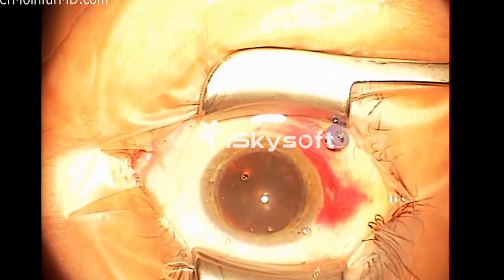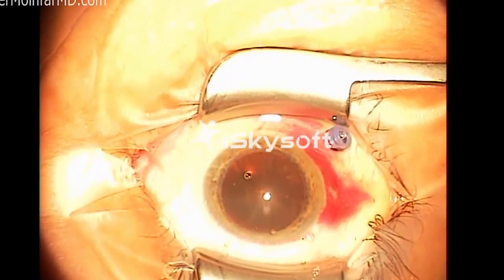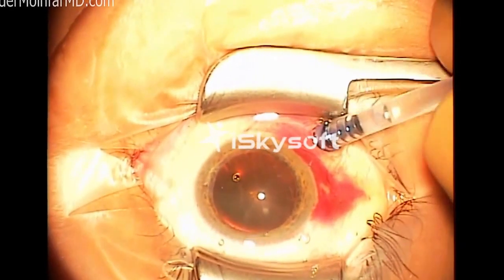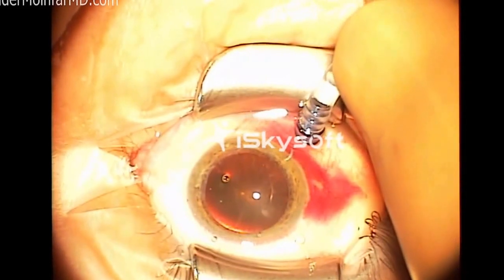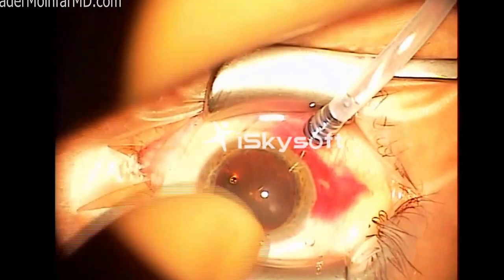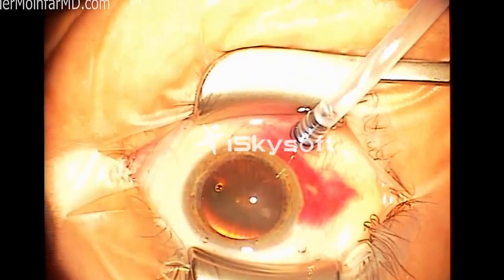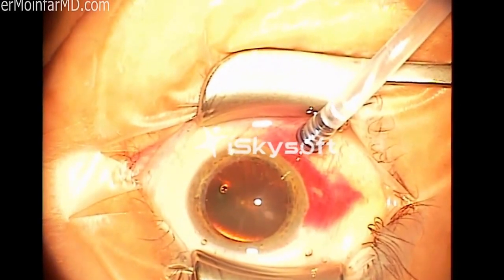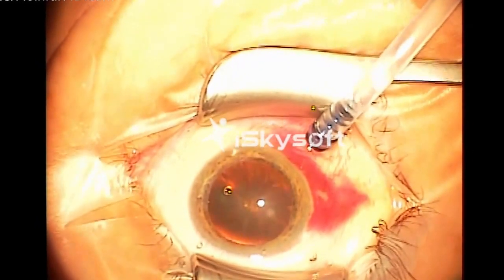What's happening now is I'm placing the first of 3 cannulas into the eye. This is a standard configuration for a vitrectomy. The silicone tube that was just attached is called an infusion line, and I'm securing it into the cannula. The other end is attached to a bottle of saline, and there's a machine that basically monitors the pressure of the fluid going into the eye.